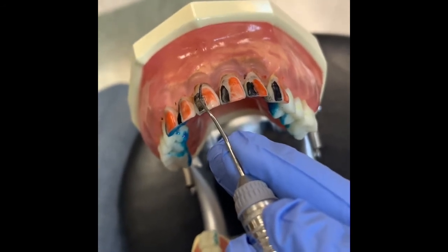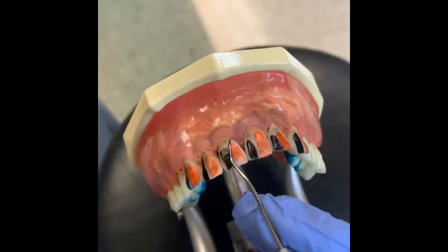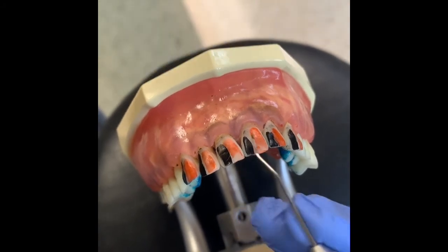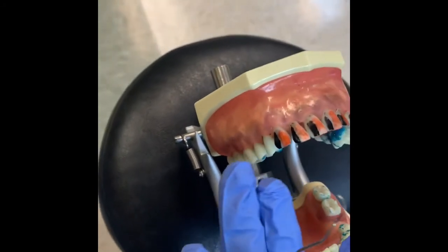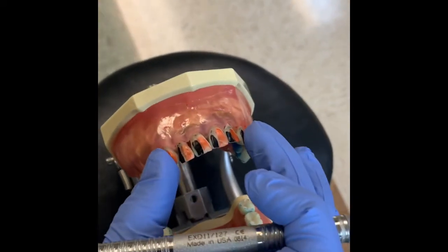Remember, we only adapt the lateral 1/3 of the working end. But you can also see my terminal shank is crossing the anterior tooth. Okay, so that is correct here. Now, when we're exploring, we work in sextants. For now, I want you guys to start with this. Later, I'll teach you a different concept. So you do the posterior sextant. Now we're going to work on the anterior sextant.